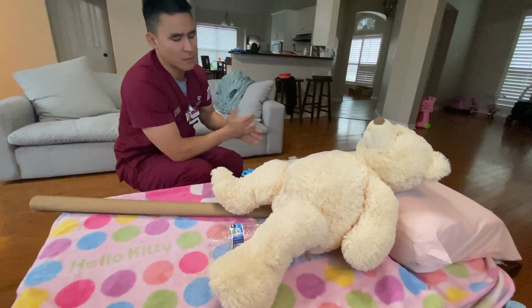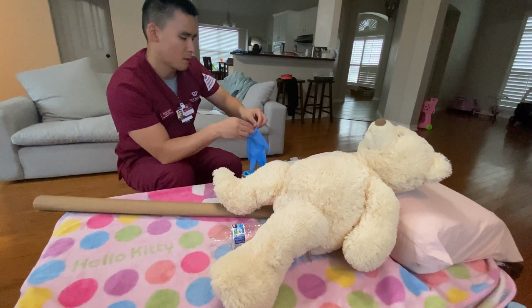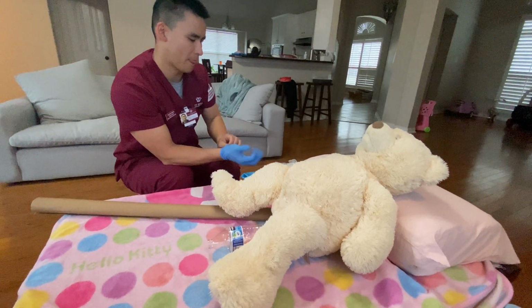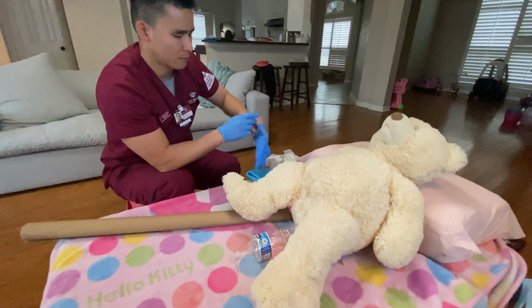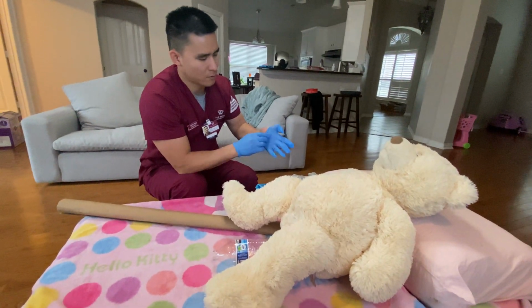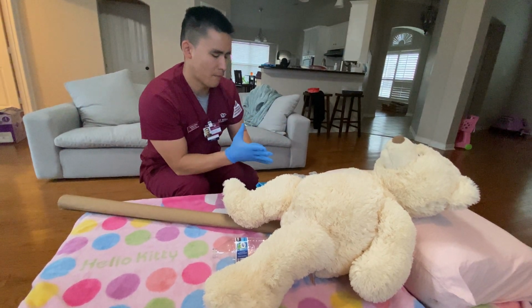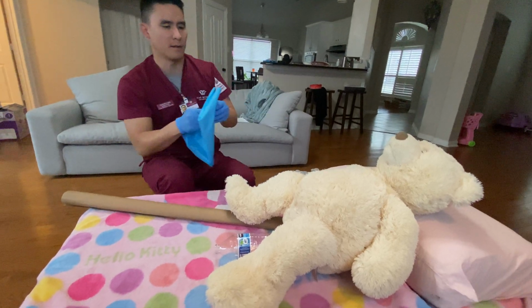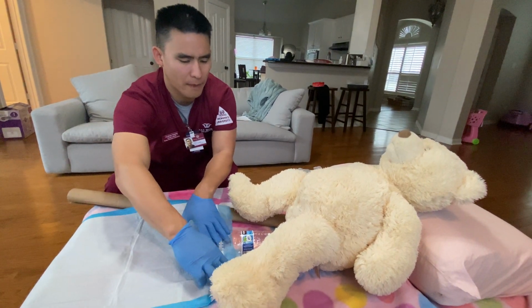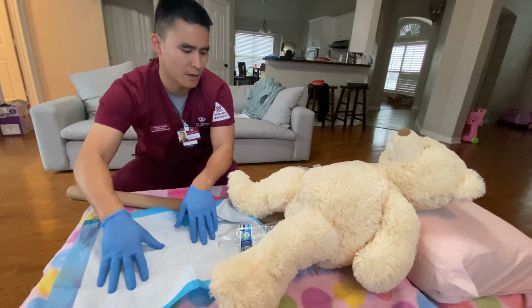So now I'm going to wash my hands again, and we'll start with cleaning your perineal area. I'm going to don my clean gloves here, since I have my supplies already set aside. Okay, and I'm going to get this waterproof pad, and help me lift yourself up. I'm going to slide the waterproof pad underneath you, and this will help keep the bed dry and catch any additional fluids that may come out.